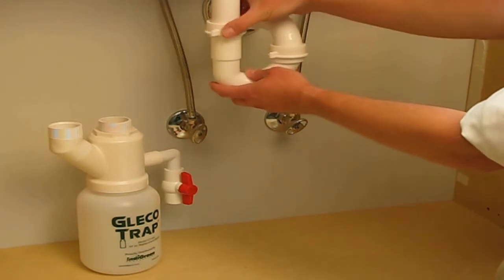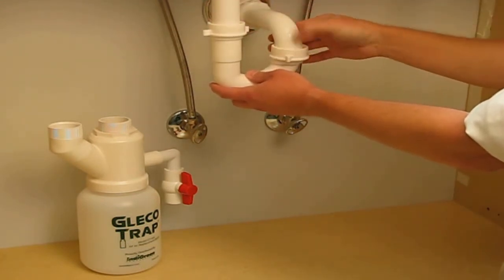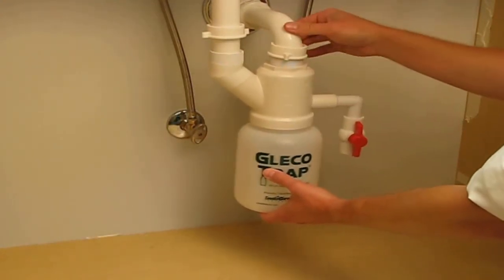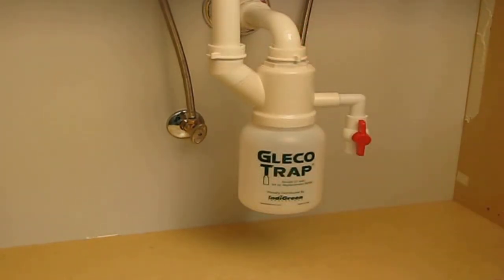The Gleco Trap is designed to fit existing 1.5 inch PVC fittings. Simply remove the existing P-Trap from under your sink. Once the P-Trap is gone, secure the Gleco Trap body in place and hand tighten each fitting. No pipe dope or Teflon tape is required.